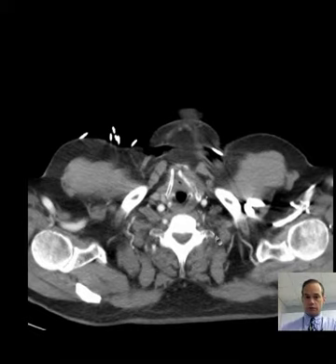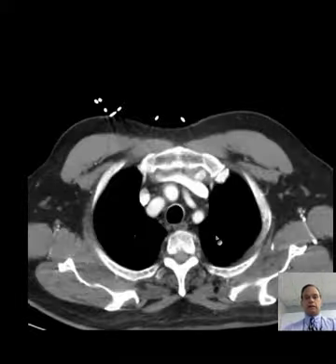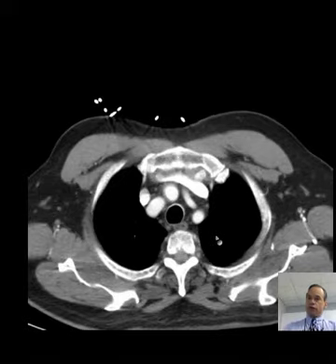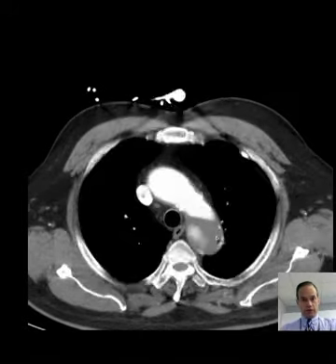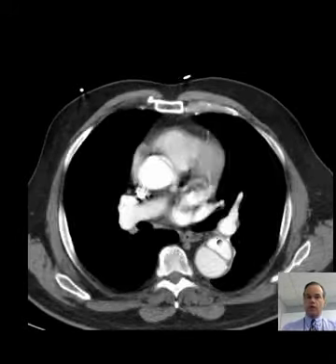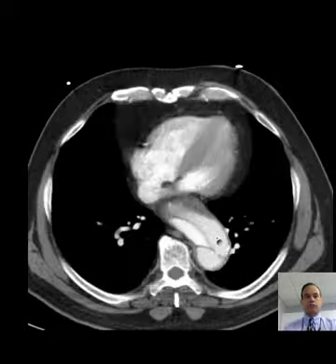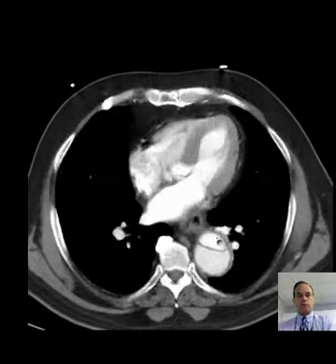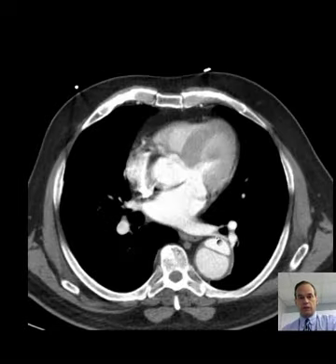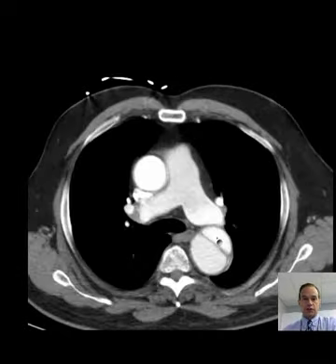Hello there, this is Dr. Mintz. I'm going to go through some cases for you. Here is a patient with an aortic dissection. Here we have an example of an aortic dissection.